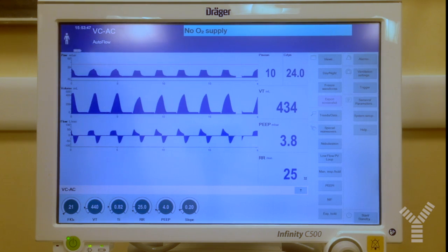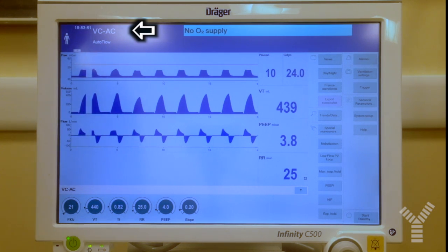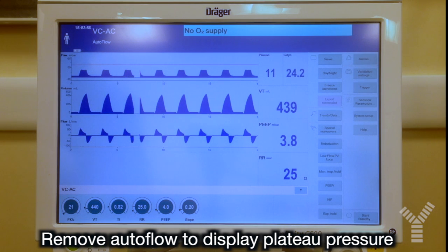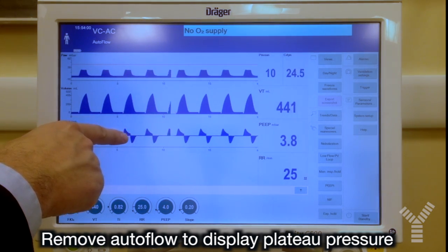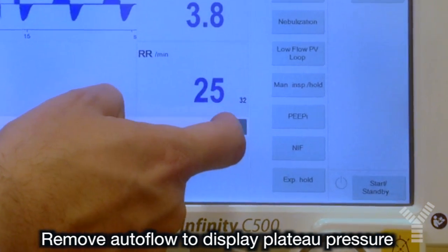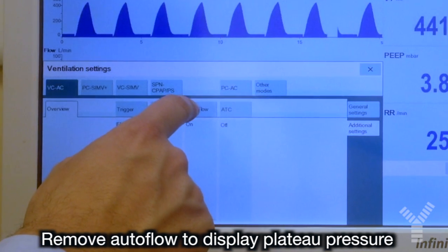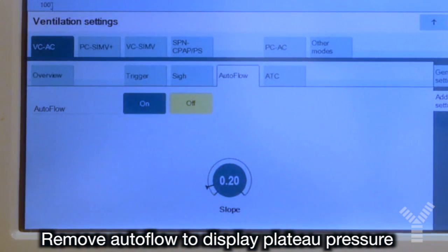This is how we evaluate physiological response to a PEEP change in a patient undergoing volume control ventilation. First we need to display plateau pressure, but we have no plateau pressure here because we are using autoflow. So we need to go to additional settings, find autoflow, and set it to off.